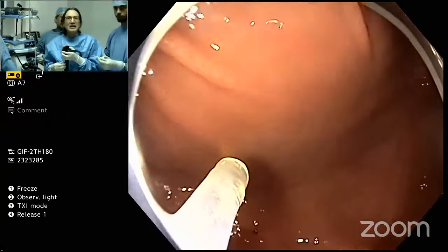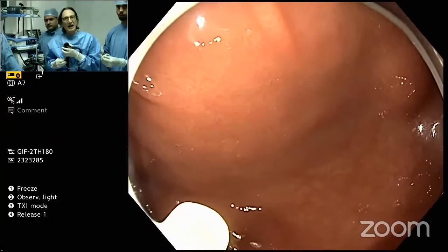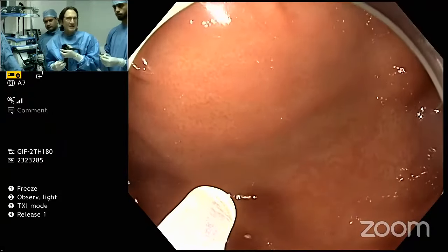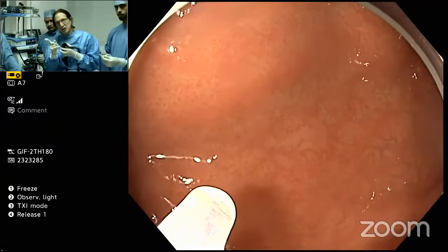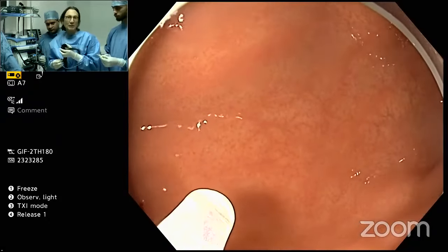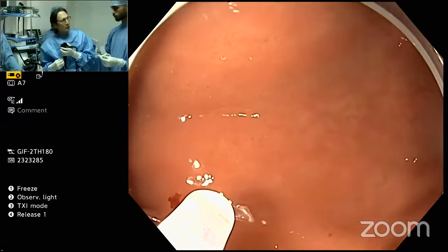Now there's no need to use double channel for this. And in fact, this was designed to enable you to do it just with a single channel, but it's a helix. I'm going to show it to you on the inside. And potentially we could just do everything through one channel. You want me to show it one channel?